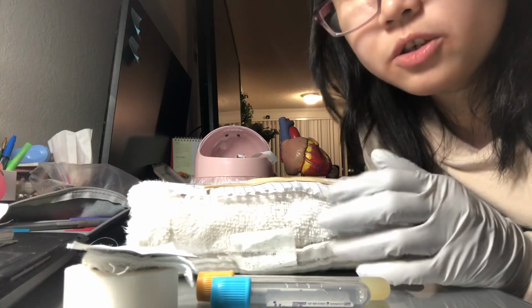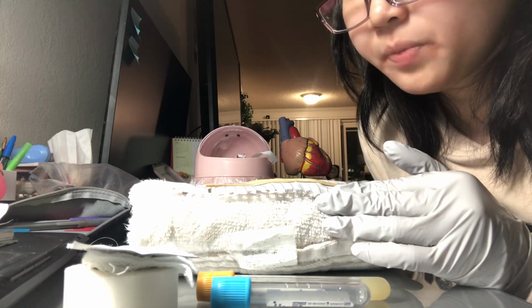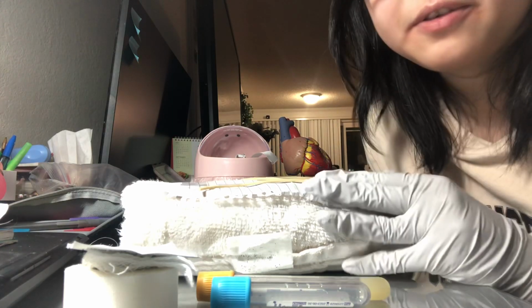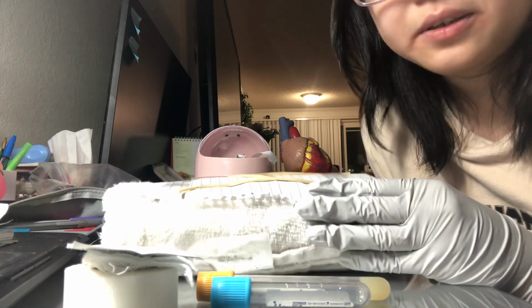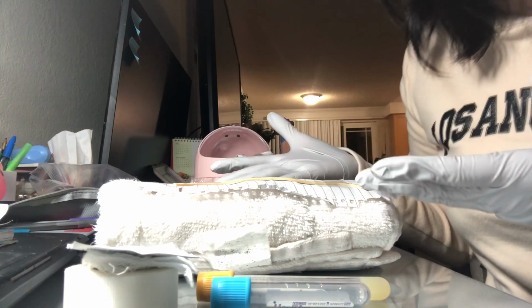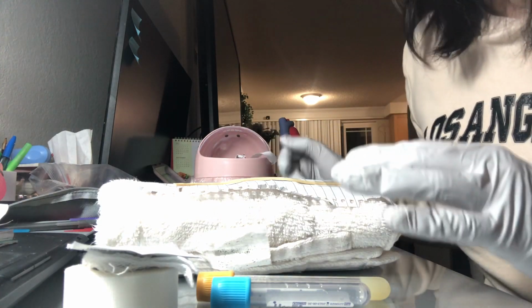Today I'm going to demonstrate the pre-collection, the collection, and the post-collection of the patient blood. So I have my gloves on, and I'm going to address the patient.